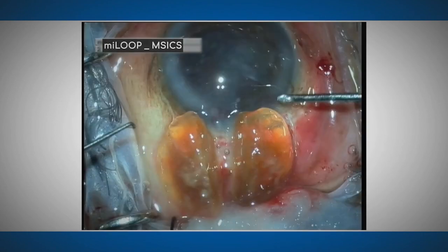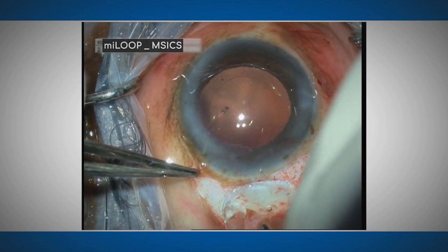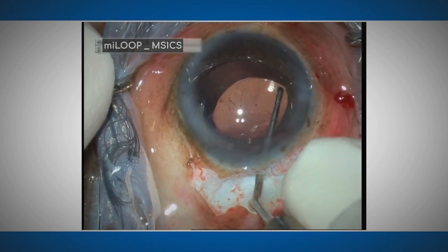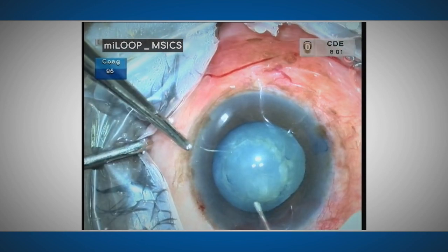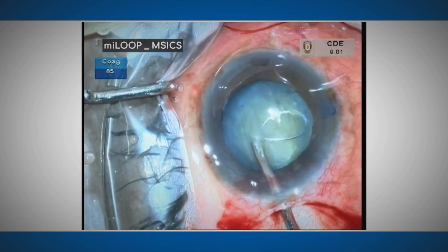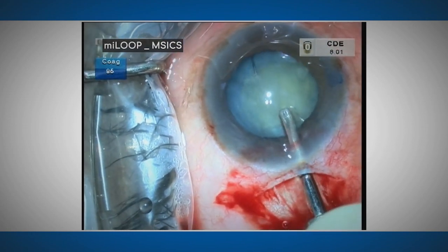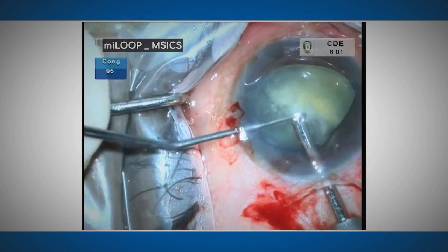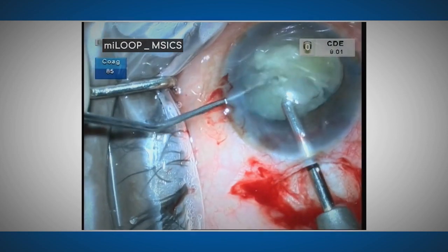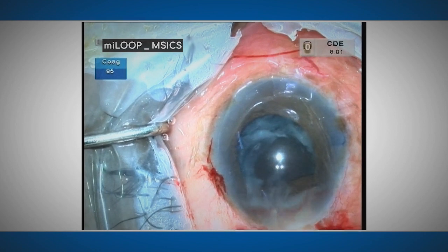After enlarging the internal sclerocorneal incision to six millimeters, both nuclear halves are delivered with an irrigating vectus one after the other. After the cortex is removed, a square edge rigid PMMA IOL is placed in the capsular bag. In Case 2, similarly, the My Loop can be used after performing a can-opener capsulotomy. The My Loop is passed under the capsulotomy margin to divide the nucleus into two halves. During this case, the nucleus partially prolapses out of the capsular bag, making the procedure more efficient, and the hemi-nuclei are aligned perpendicular to the wound and delivered.